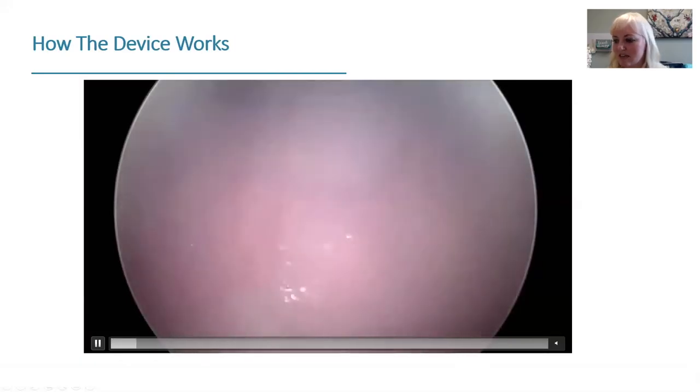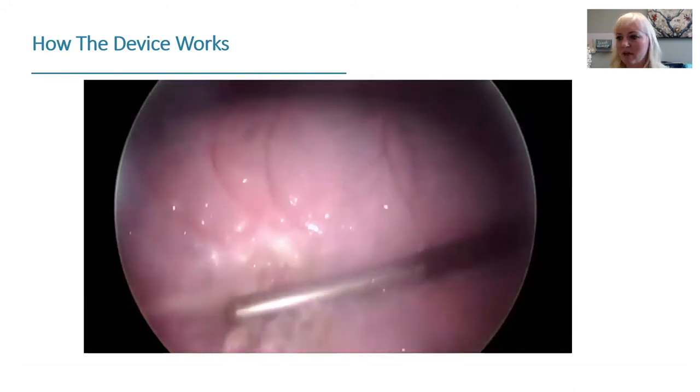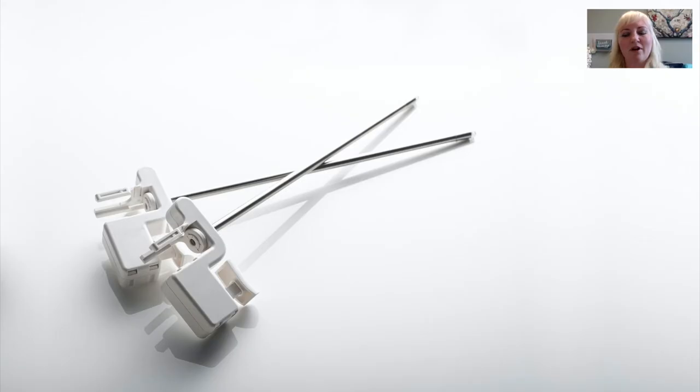How this works is: this is a device that fits over the laparoscopic camera. It has an optically clear film that fits over the tip of the camera, and that film is spooled in the handpiece. The handpiece gets locked on the camera, and when you need to clean the end of the scope, you click the trigger and a new length of film is advanced over the scope. The film also has hydrophobic properties, and one device allows you to have 60 clicks to clean the end of that camera.